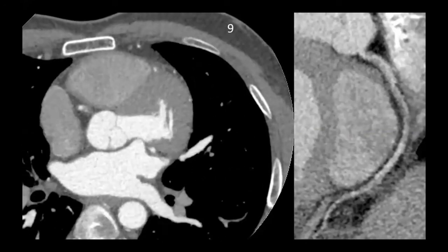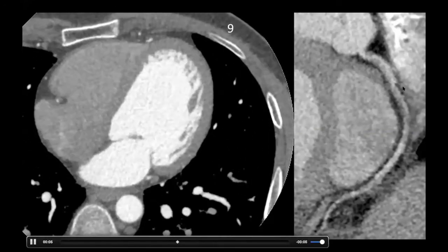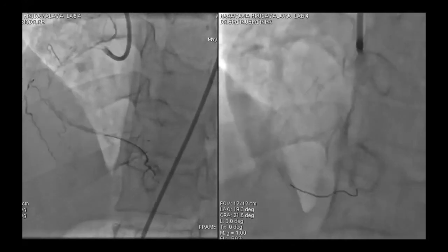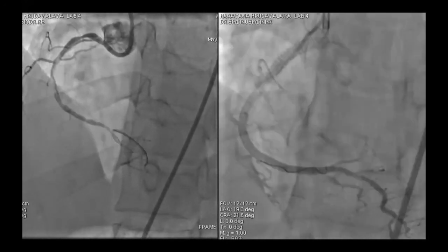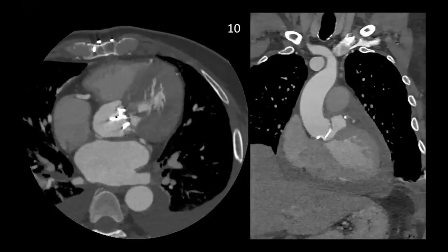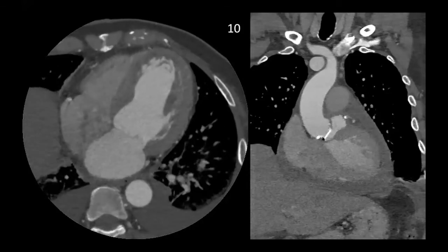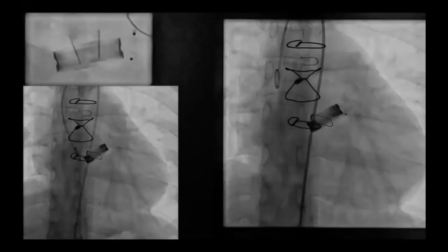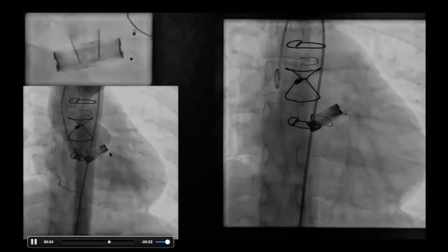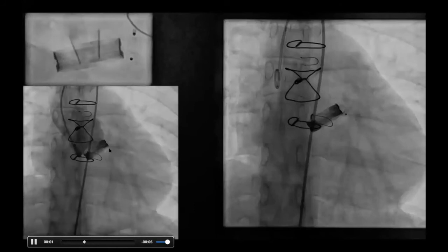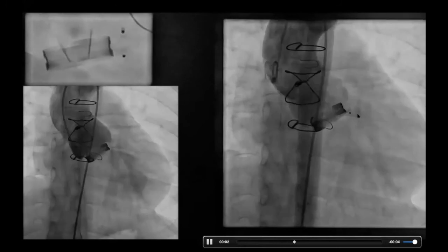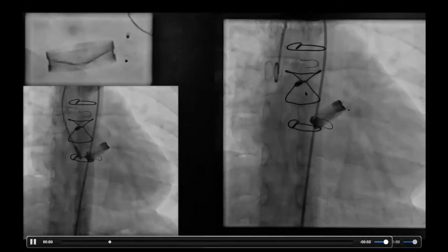Looking specifically at coronary arteries, this patient has a diffusely diseased RCA with areas of dissection visible in the vessel; this patient underwent catheter angiography and a stenting procedure. Another patient with non-coronary applications had an aortic valve replacement with a paravalvular leak, which was very useful in surgical planning. The patient underwent image-guided intervention; you can see the initial paravalvular leak along the valve and post-procedure the plug has been placed, sealing the leak nicely.